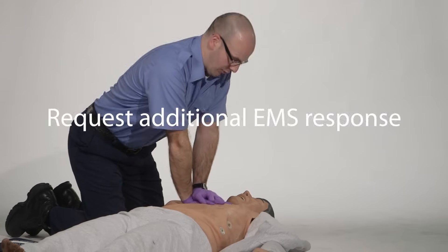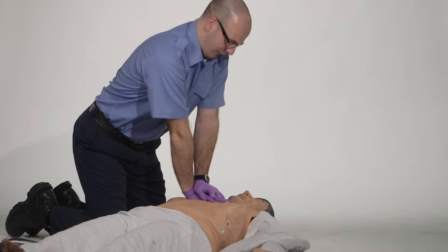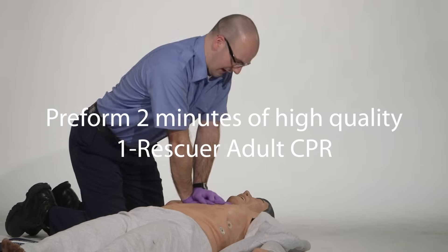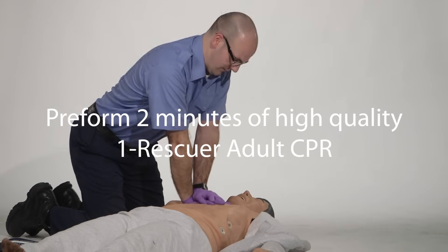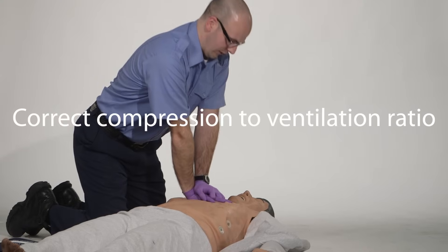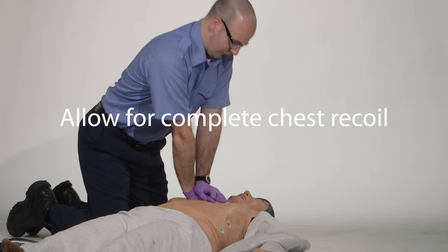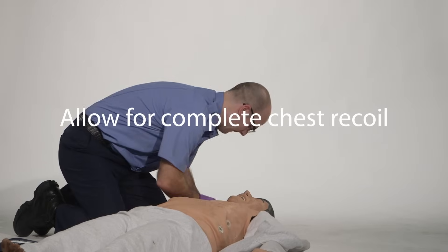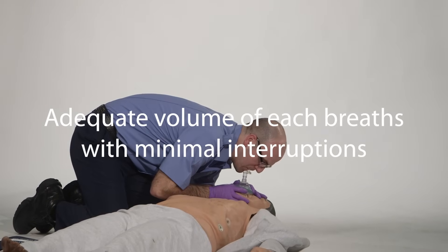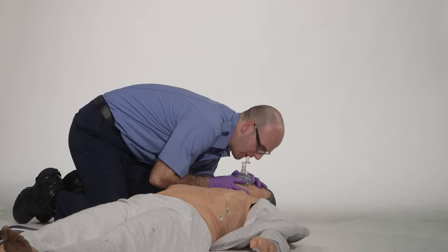Request additional EMS response and perform two minutes of high quality one-rescuer adult CPR with adequate depth and rate, correct compression-to-ventilation ratio, allowing the chest to recoil completely, adequate volumes of each breath, and minimal interruptions of less than 10 seconds throughout the event.